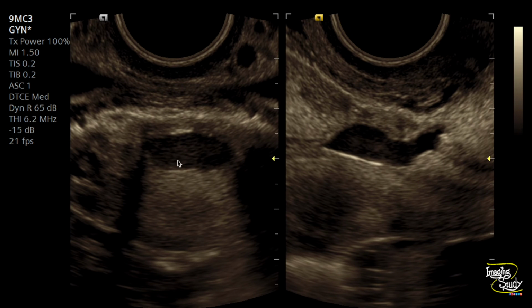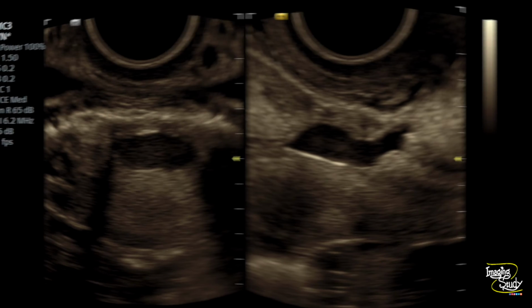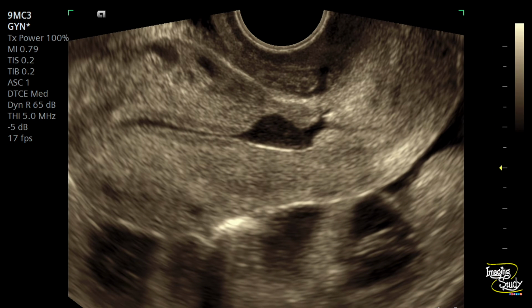And here's the still image. It is slightly magnified, and you can see the collection is not completely anechoic. Rather, it is hypoechoic, indicating the menstrual blood. It's quite similar to the endometrium. Here's again the CS scar niche containing the menstrual blood as a storage area.